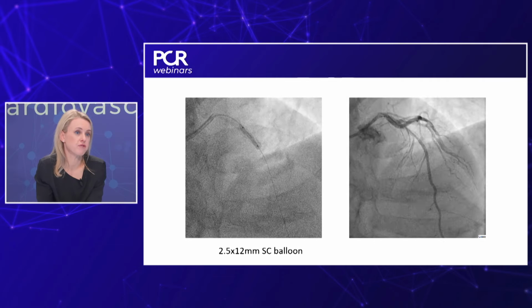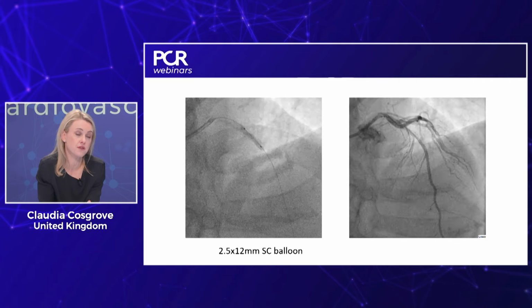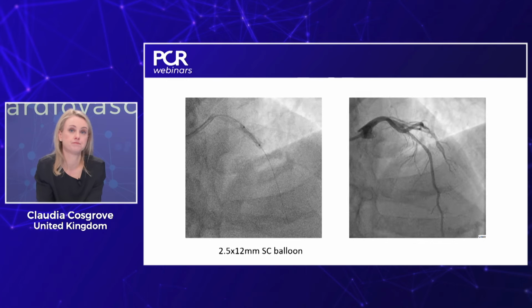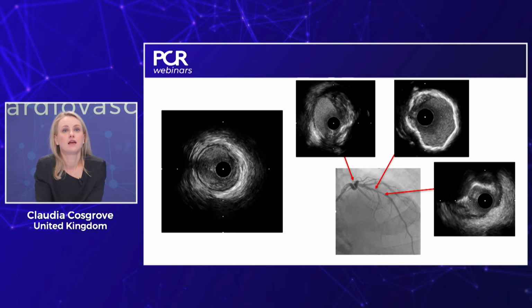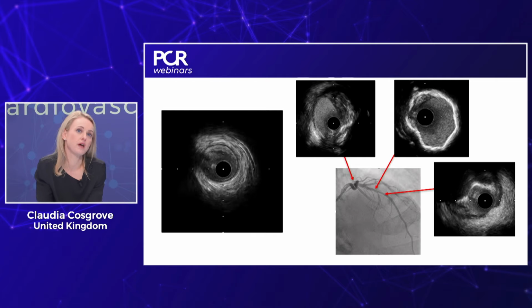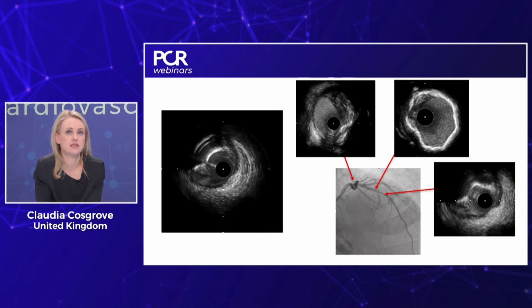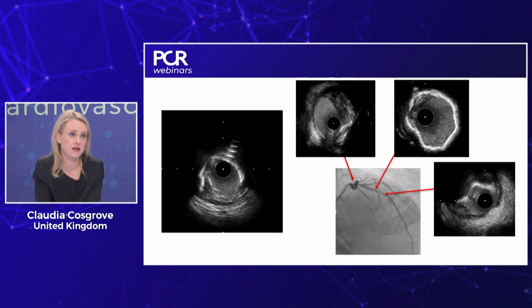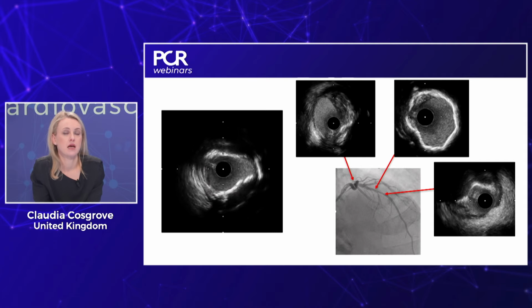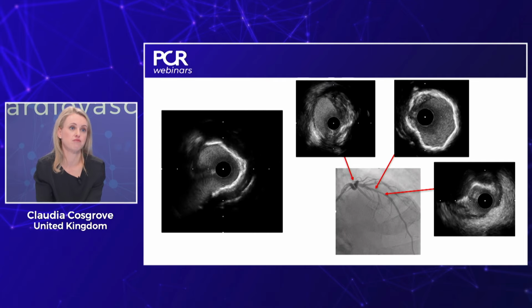Next we did some intracoronary imaging to better assess the degree of calcium, the pattern of the calcium, and also the vessel size. So we went on and did an IVUS run. Here we have the IVUS pullback playing, and I've highlighted a couple of points of interest throughout the vessel. Distally there was an area of eccentric calcium, almost a calcific nodule at the site of a large septal. Proximal to that, there was an area of concentric calcium, almost a 360-degree ring of calcium.